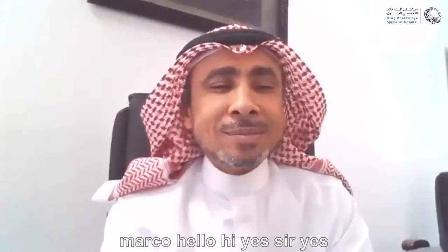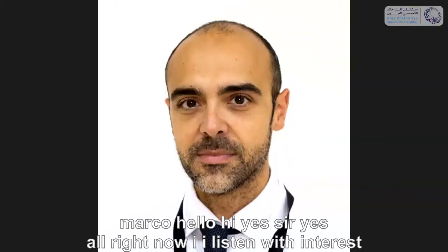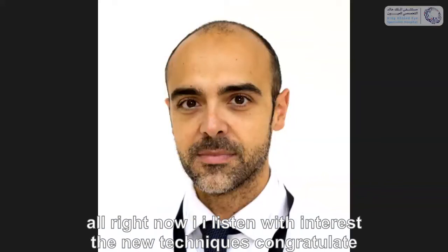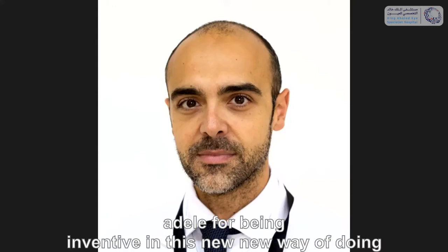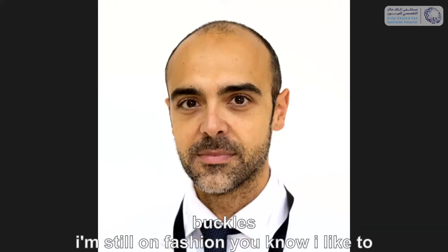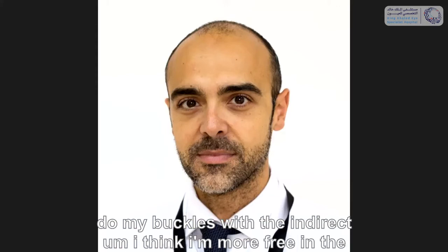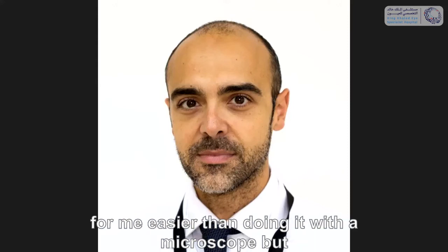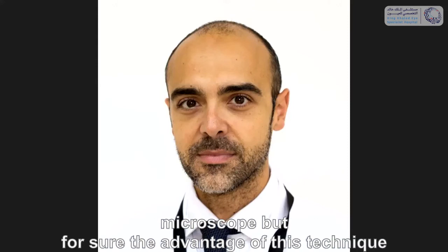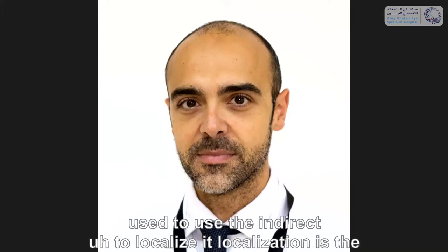Marco? Hello, hi, Hassan. Yes. Hi, now I listened with interest to the new techniques. Congratulations to Adel for being inventive in this new way of doing buckles. I'm still old fashioned, you know, I like to do my buckles with the indirect. I think I'm more free in the movements, and it's easier for me than doing it with a microscope. But for sure, the advantage of this technique is that it's easier for someone not used to the indirect to localize.